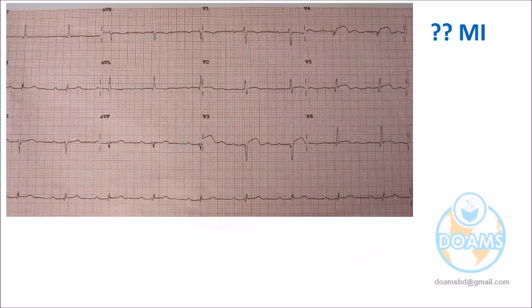You will tell that, oh, it is also not MI because I am discussing this. What is your opinion? Is it MI? Curved up ST elevation, pathological Q, T inversion. Can anybody identify? Quickly, doctor. We have to finish other things. Is it MI? Which area?